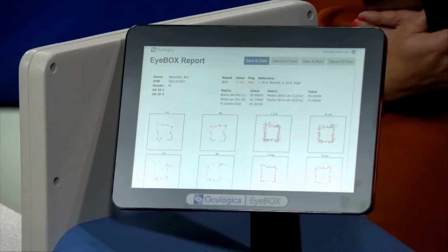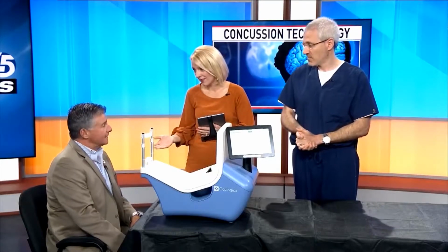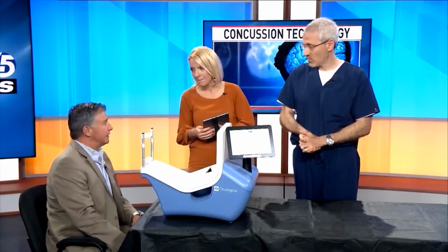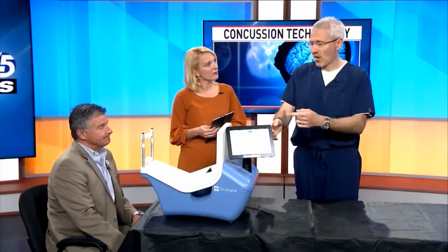In his case, my guess is that he's probably always going to be positive because he suffered multiple concussions in the past. You said you did motocross, and you've gotten hit a couple of times. Yes, ma'am. But not recently. 2 years ago, I had a fall in a parking lot. And you had long-standing problems from it. So that's probably why it's reading high.